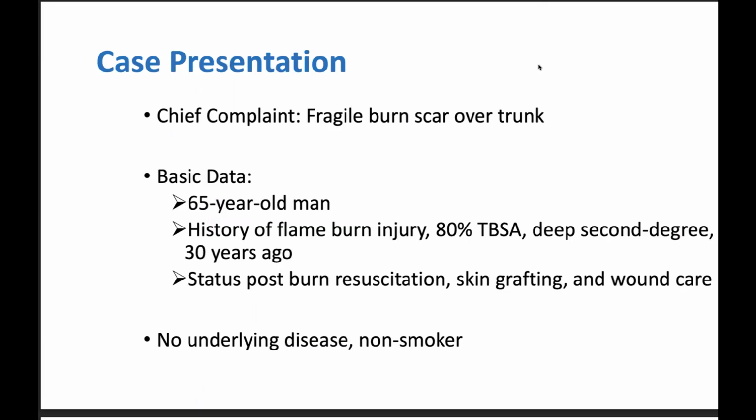So I will present a case which I treated. The patient's complaint is that he has a fragile burn scar over the trunk and all over his body. The basic data of this patient is a 65 years old man. He had a history of flame burn injury, 80% TBSA. Wow, it's a big injury. Deep second degree to third degree. The incident happened 30 years ago.